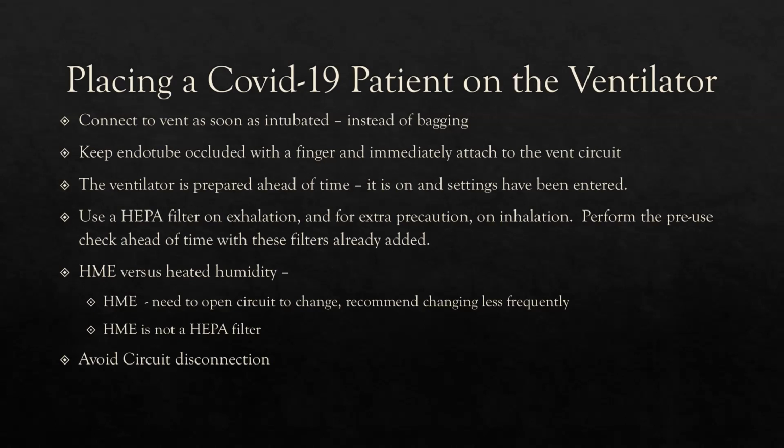So you want it to accumulate moisture. That's how it's providing humidification to the airway. And if you take that out, throw it in the garbage and put a dry one in, you're drying out the airway. And now the little cilia can't work and you get mucus plugging. In the HME, yeah. If you see a layer of water, that's going to create a resistance to flow. That you would change. But condensation should be there. Oh, and that's good.